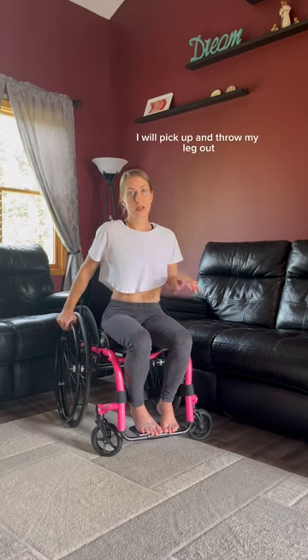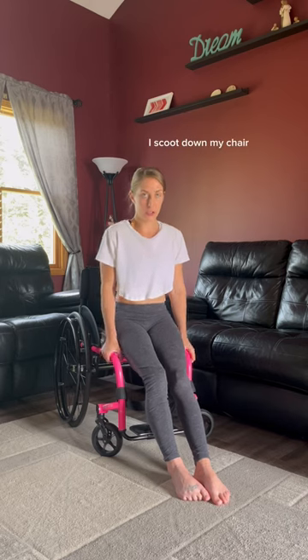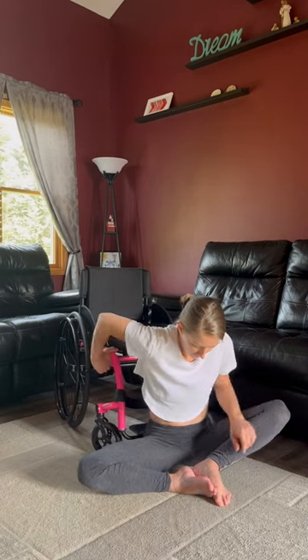From this position, I will pick up and throw my leg out. From this position, I scoot down my chair, then onto the floor.